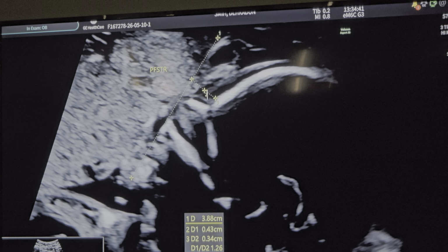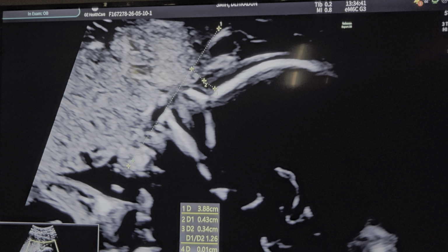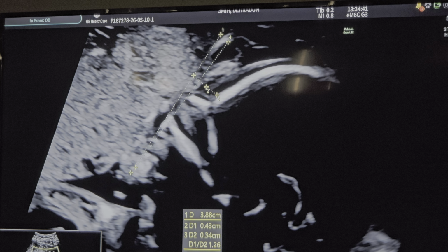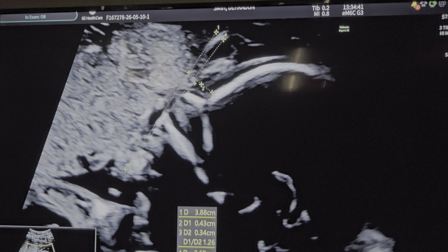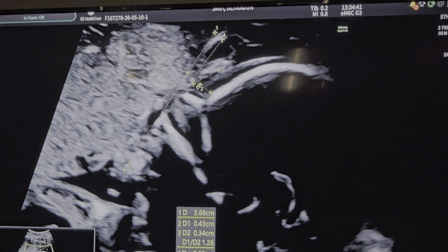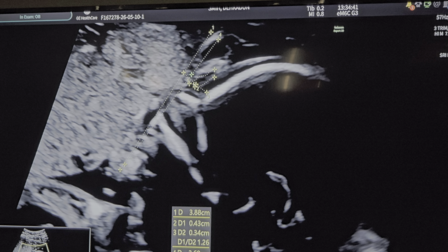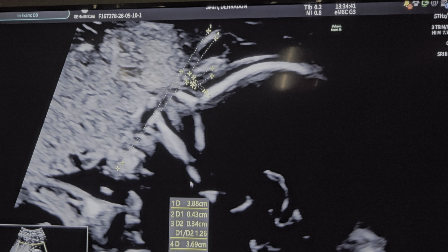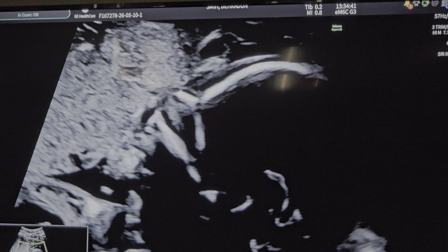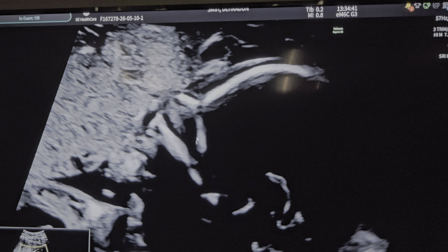So in Down syndrome, what happens, I tell you, the mandibulomaxillary line will come like this and the prefrontal skin thickening will be here. It will go like this. Here it is now, but it will come like that. So if you take the distance, it comes like this. So what is the PFSTR now? It is 0.27. So PFSTR is a very important marker of both maxilla shortening and prefrontal skin edema.